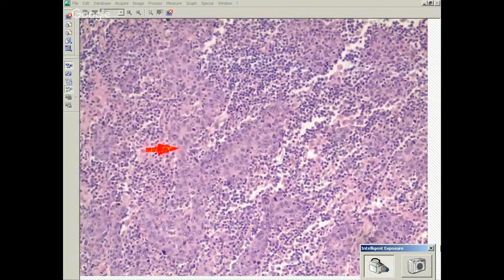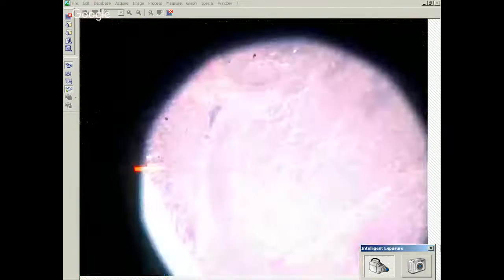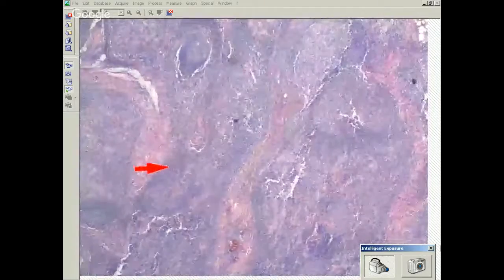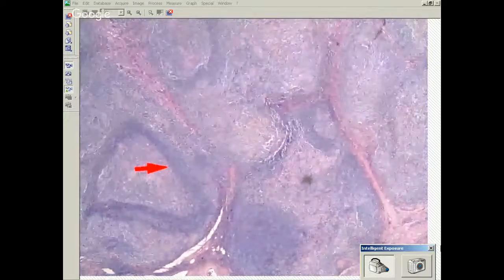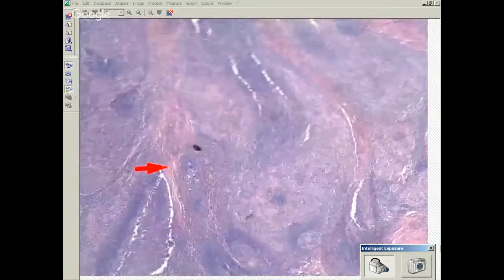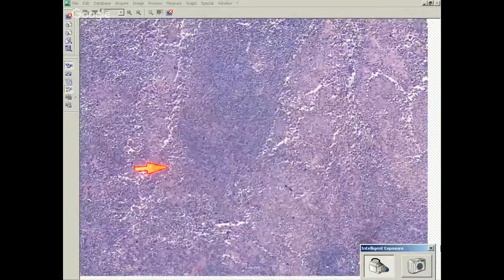Does anyone know? Lymphoepithelioma-like carcinoma, otherwise known as medullary carcinoma. So it's actually a poorly differentiated carcinoma. It tends to look like this. It's actually quite subtle. If you look at it on low power, there are way more lymphocytes than there is carcinoma, right? So if you don't look closely, you could easily misdiagnose this as a lymphoma, or even if it's small, you could misdiagnose it as a reactive lesion, right? So in this case, this is a lymphoepithelioma-like carcinoma.